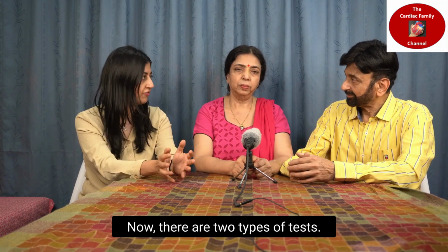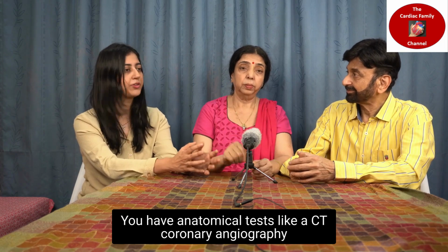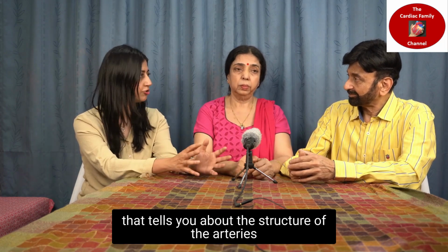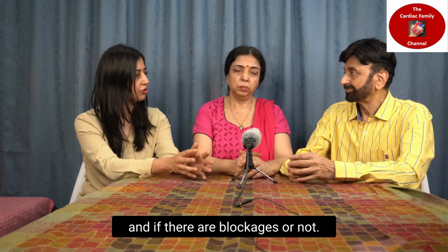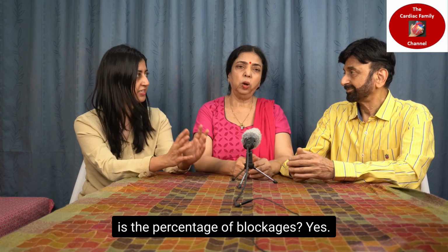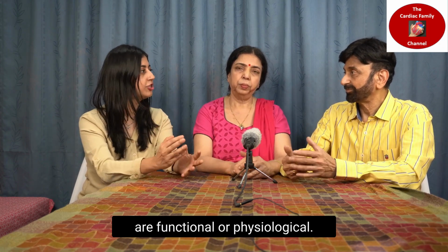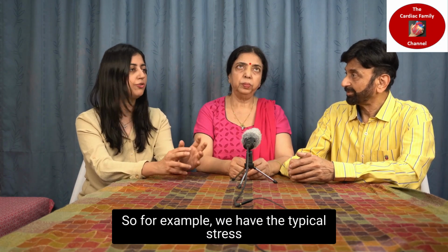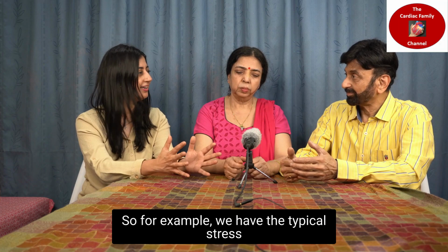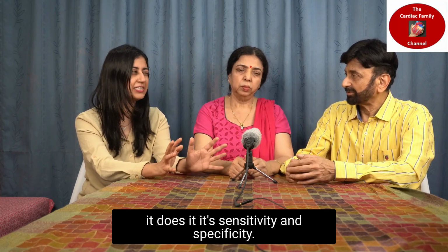Now there are two types of tests. You have anatomical tests like a CT coronary angiography, that tells you about the structure of the arteries and if there are blockages or not, and if there are blockages, what is the percentage of blockages. The other type of tests are functional or physiological. They are stress test based tests. So for example, we have the typical stress test, which has actually become quite old because its sensitivity and specificity is quite low.